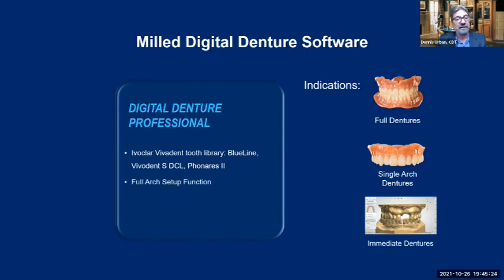So we can set up, I talked about setting up denture teeth earlier, one at a time. It takes a while to set up a denture. We can do full arch setup functions where all those teeth come into play in a virtual articulation at one time. And we can do separate adjustments too.